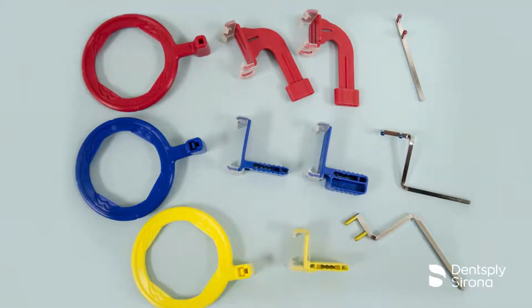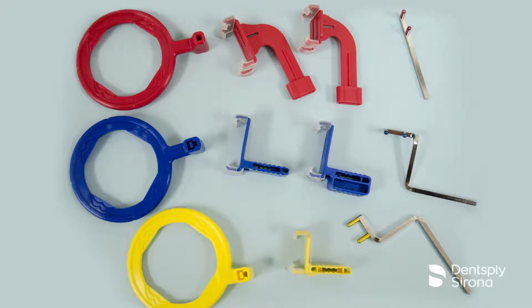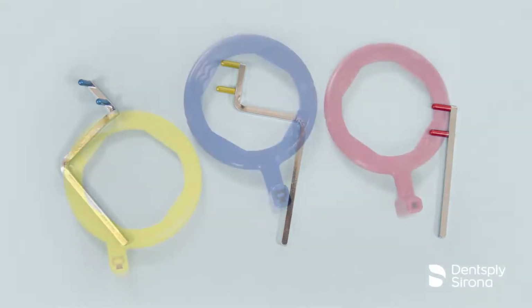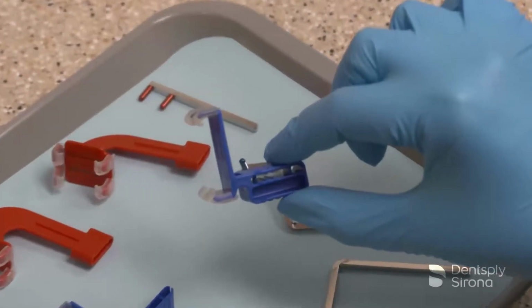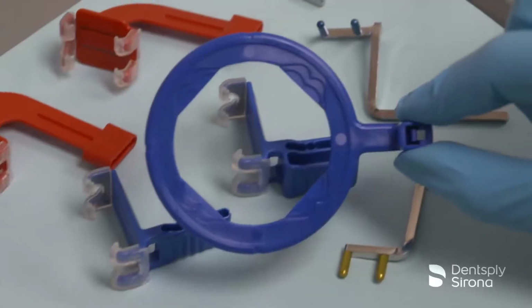The XCP Short Arm aiming device uses the XCP DS Fit universal sensor holder and the traditional arm and ring sets, which consists of 3 metal arms and 3 color-coded rings corresponding to the area they will be used in the mouth. The blue bite blocks correspond with the metal arm with the blue pegs and the blue ring.